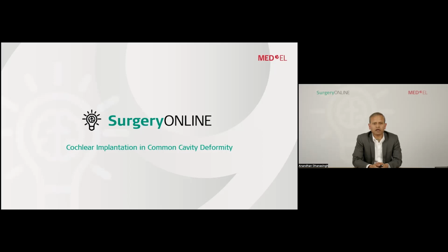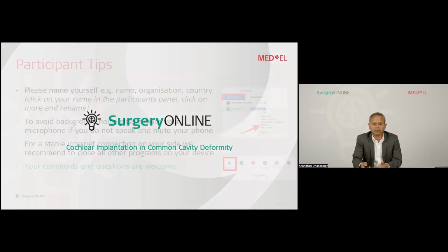My name is Dr. Anandhan Dhanasingh, and currently I'm serving as the head of Translational Science Communication within the Research and Development Department at MED-EL headquarters. Together with my colleagues here in the studio, Ms. Christina Meyer and Anna Deem, we would like to welcome you all officially to this episode of the Surgery Online webinar series. I'll be your moderator for today, and we will be watching cochlear implantation surgery in common cavity deformity.